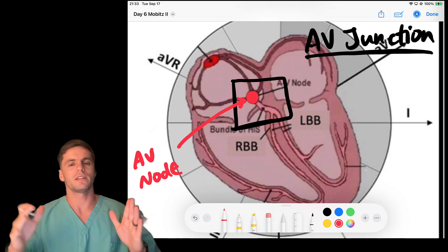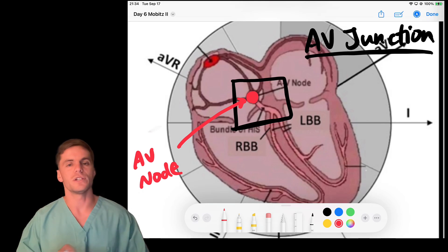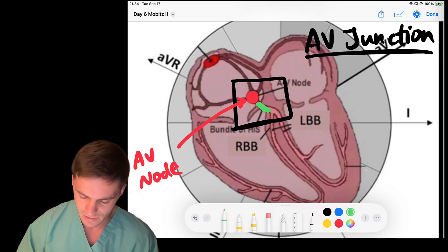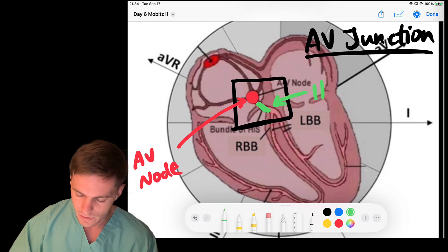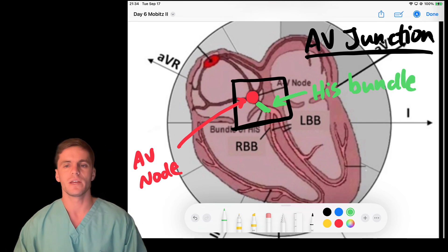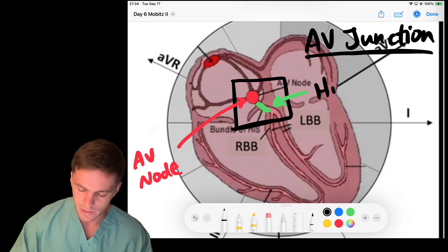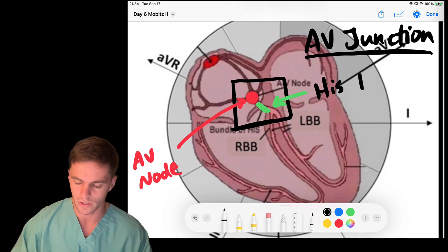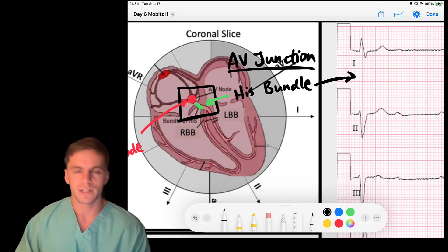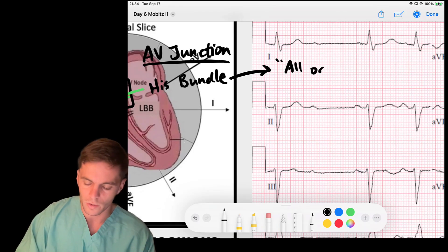So we get PR interval lengthening, lengthening, lengthening, then a drop — that's the AV node proper. Just beneath it is the bundle of His — the His bundle. The His bundle is the area of interest for today's video, and it's where second degree Type 2 AV blocks occur specifically.